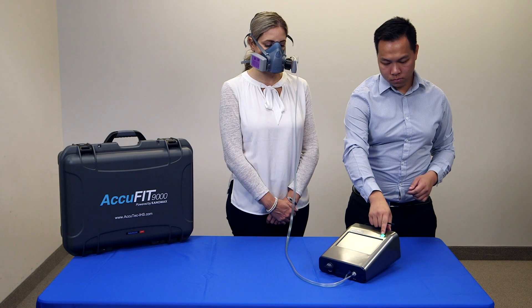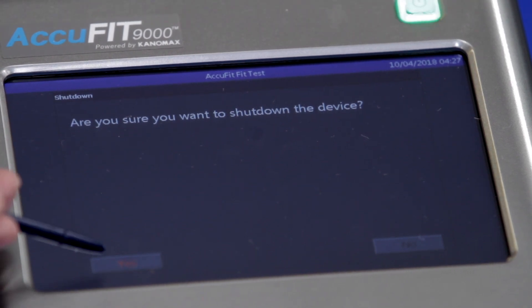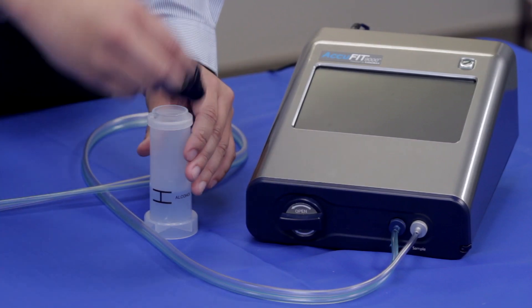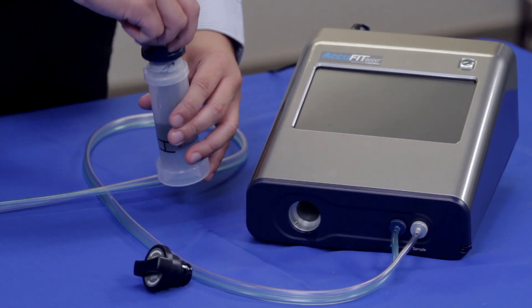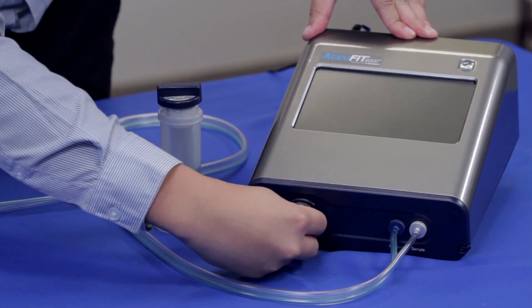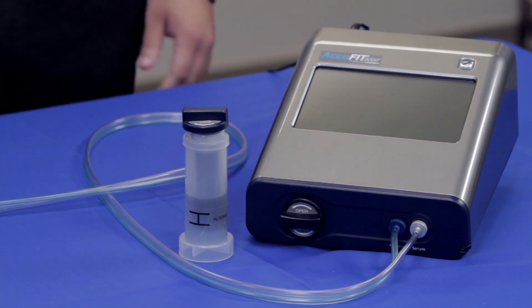To turn off the AccuFit, press and hold the power button until it flashes red. You will then be asked to confirm that you would like to shut down the device. Tap Yes to complete the shutdown. After use, the alcohol cartridge must be removed from the instrument, reinserted into the alcohol storage container for safe storage and transport. To keep the inside of the instrument clean, cover the cartridge inlet with the storage cap.